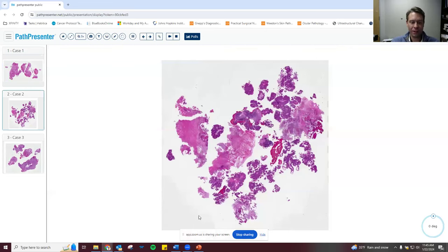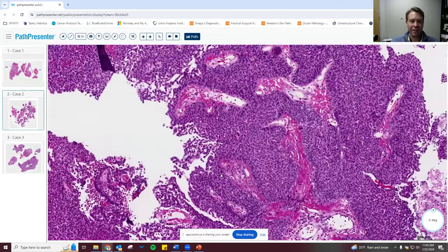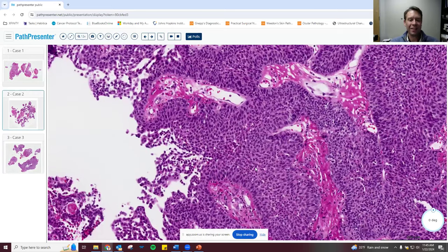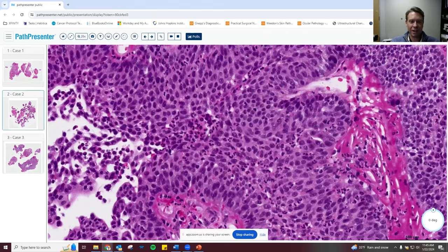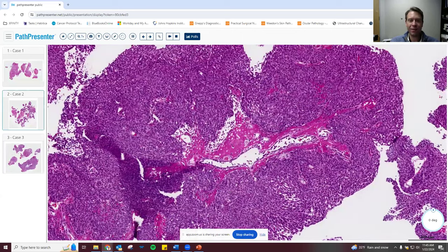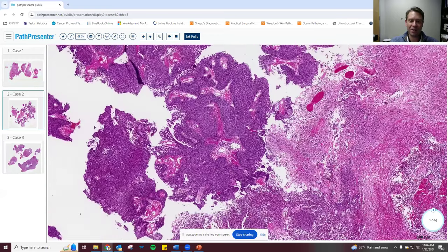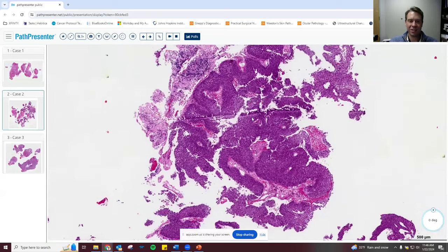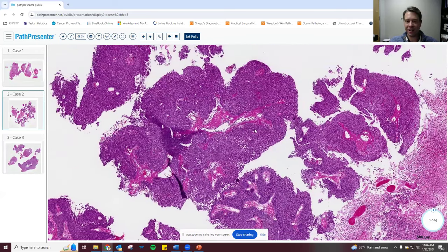Case two: a 60-year-old woman with a 2-centimeter nasopharyngeal mass. Even from low power it looks very papillary. Looking closer, all cells look similar; unlike the last case, these aren't the most malignant cells — you'd have trouble finding a mitosis. But there's a nice clue: all of these transmigrating neutrophils. Your ENT colleague may say this looks like a Schneiderian carcinoma ex-papilloma, or an inverted papilloma with high-grade dysplasia or a carcinoma arising out of it. This is a great histologic appearance for the DEK-AFF2 carcinomas, currently considered a variant of non-keratinizing squamous cell carcinoma in the WHO.